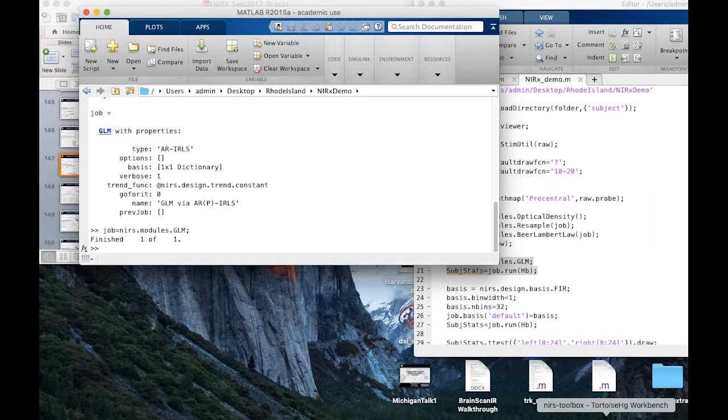By dealing with these robust stats, I still have the noise in the data. If I didn't have the noise in the data, my T-scores would be higher. But because I've chosen the right statistical model, my T-scores are correct. And if you plot out false discovery rate and so on, you have no uncontrolled type 1 error. We spent a lot of time getting that right.